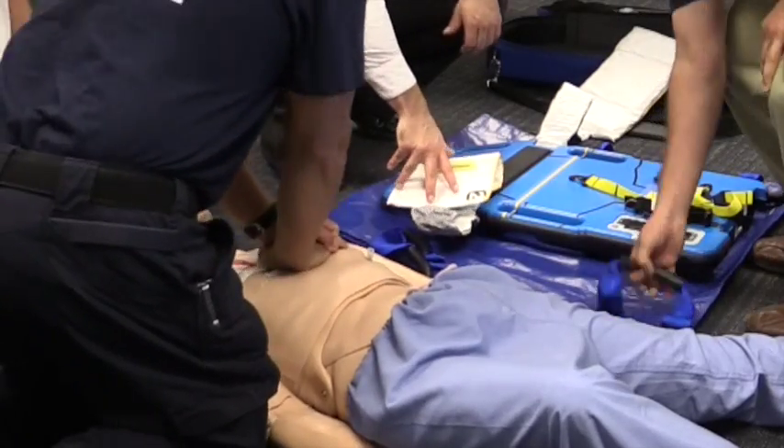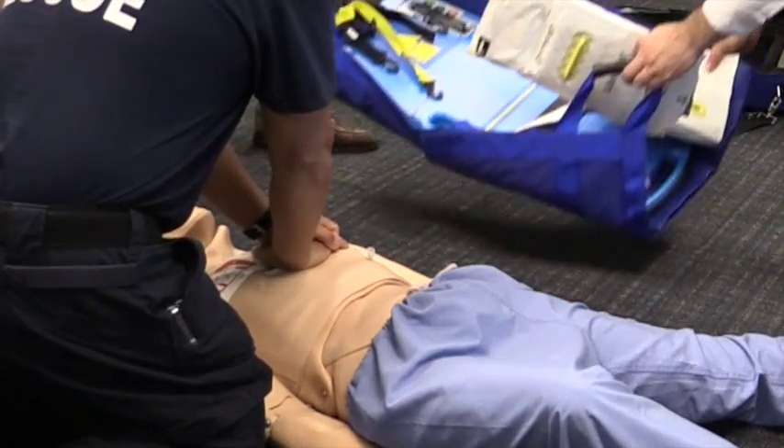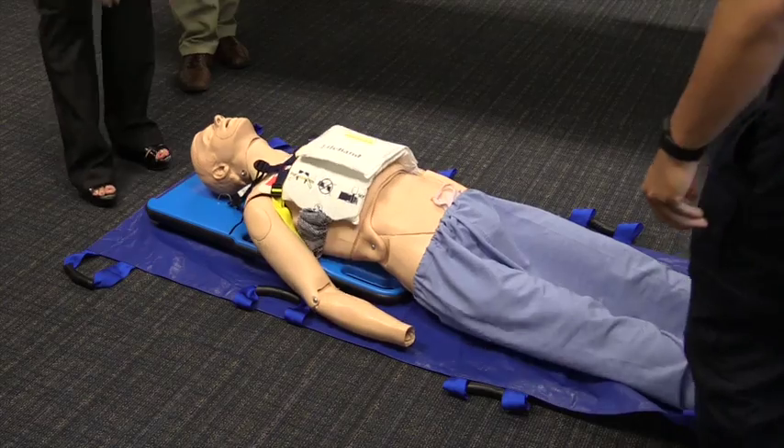Eventually, everybody gets exhausted, and this is where performance starts lacking with CPR. You get tired, you're not compressing enough, you're not going fast enough. You don't have those worries with this device.